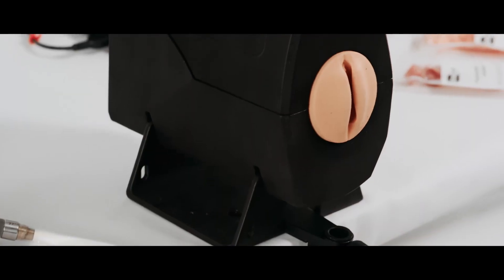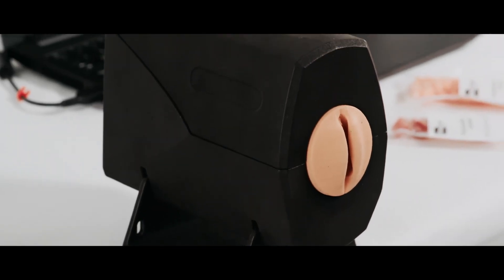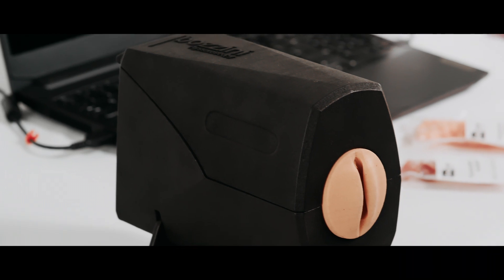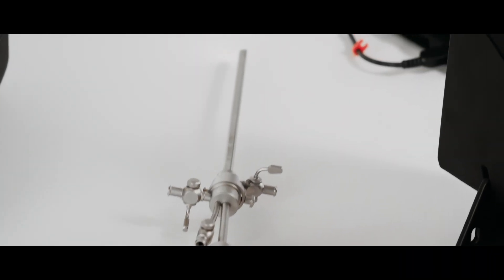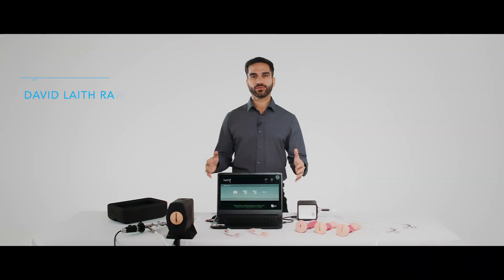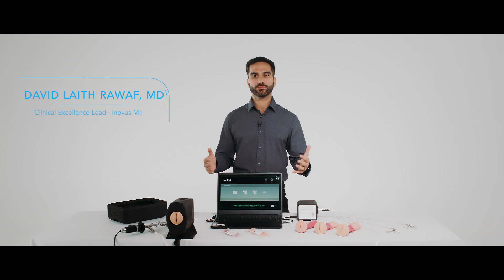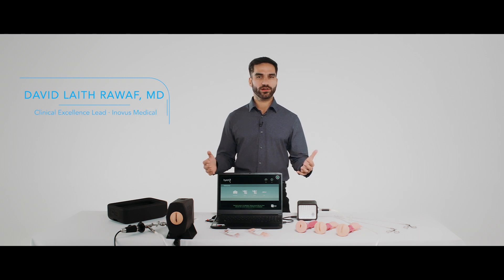Our innovative natural haptic models and real hysteroscope allows for universal collaboration with real-world medical devices, further enhancing the training experience.